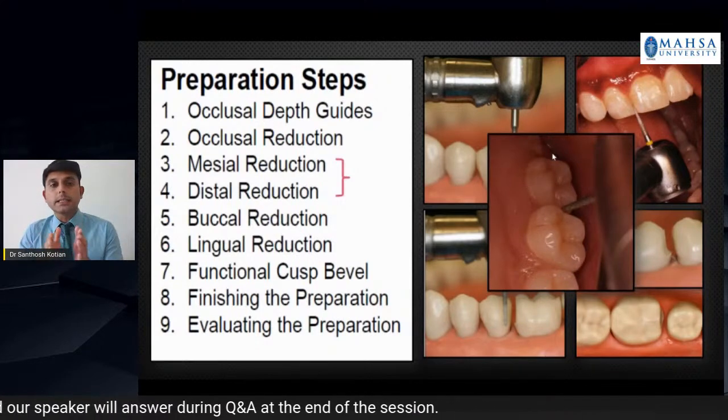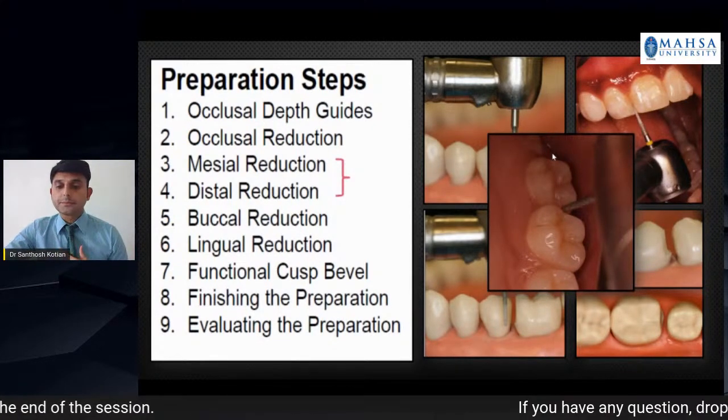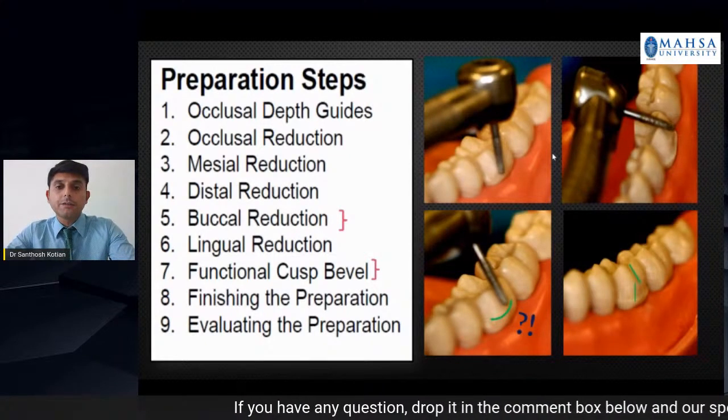But yes, of course, it needs a little bit of experience so that you don't end up doing over tapering. Coming to buccal and lingual reduction, again, follow the planes.